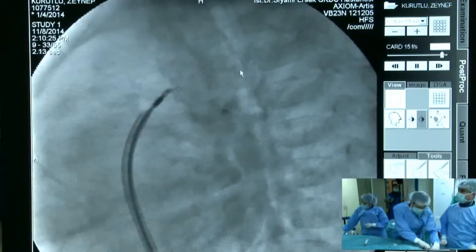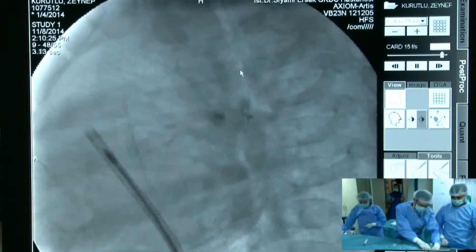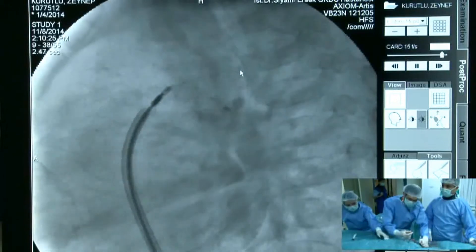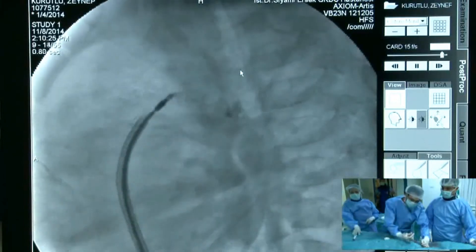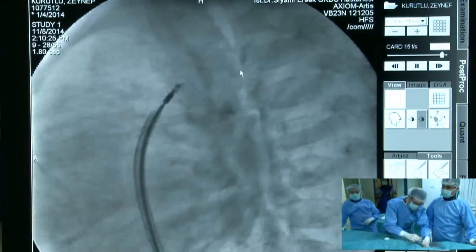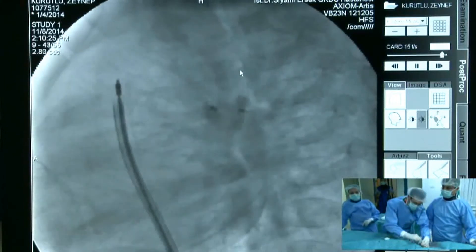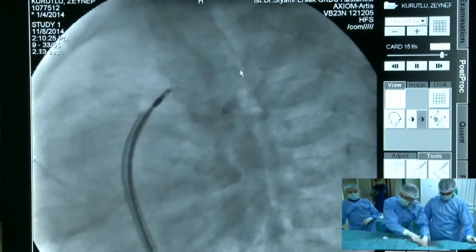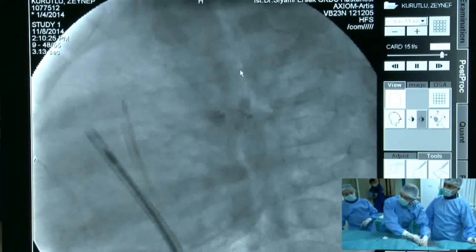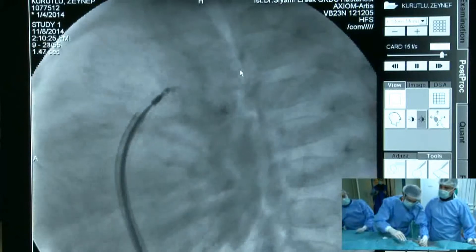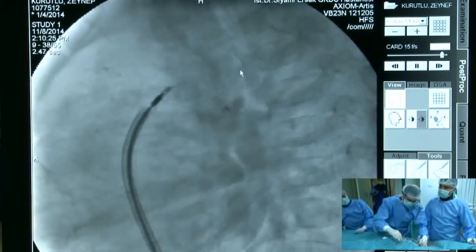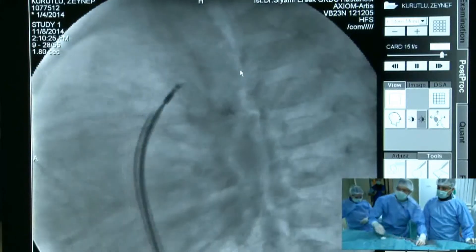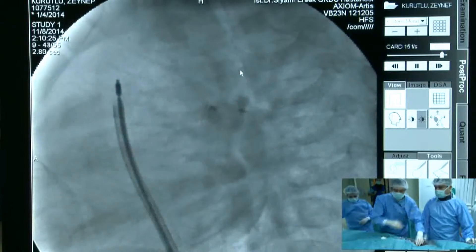We obviously decided to deploy and release the device. Now we need a control injection. Which projection do you prefer — right oblique or left lateral? I think the RAO projection at 40 degrees would be best.